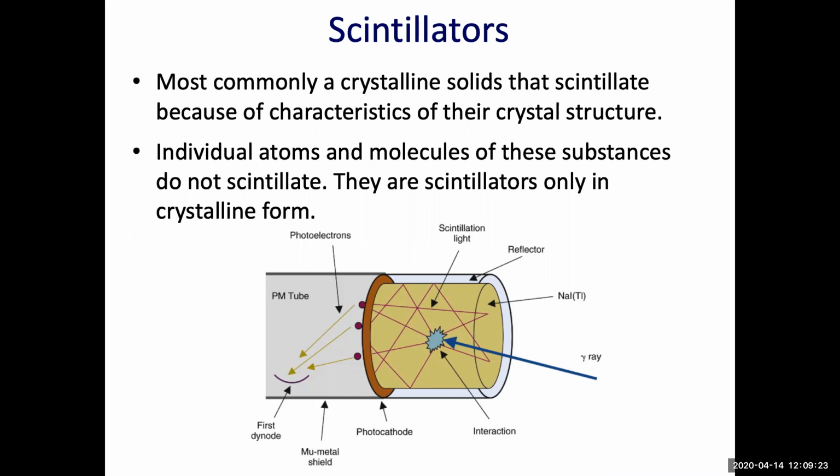During the de-excitation, the difference between the two states will be emitted as light instead of X-ray or whatever radiation is emitted in an X-ray apparatus. So this is the property of the crystal that produces light: it converts the energy of the incident radiation to light. Okay, this answers your question.